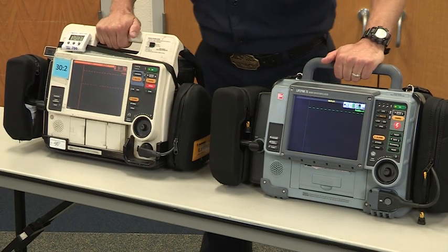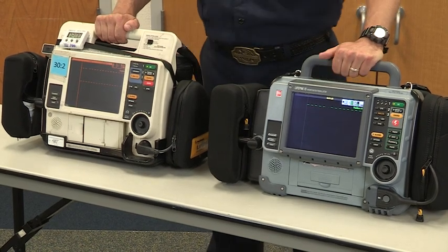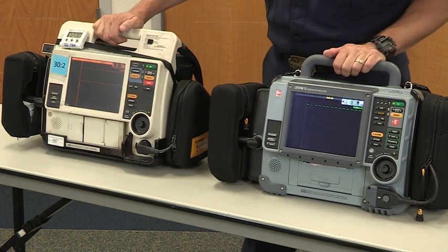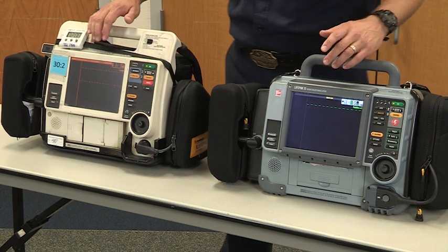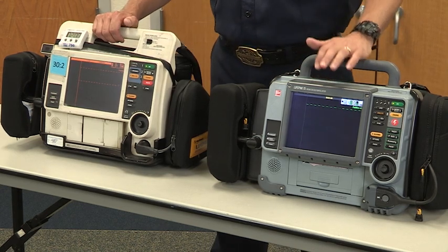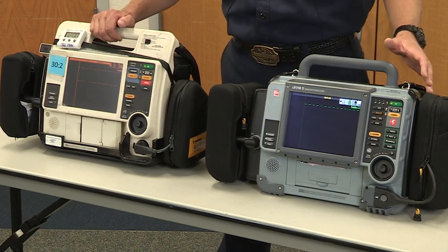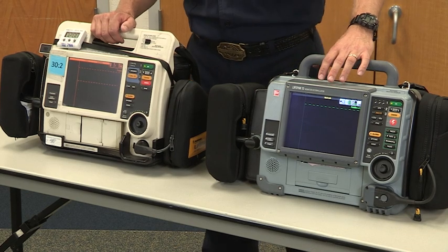Okay, now I've got each machine side by side so that we can view the similarities and the differences. Each machine functions identical to the other one as far as charging and shocking, button location, and printout and reading. However, there are some differences on the LIFEPAK 15 that I'm going to give just a brief overview of right now, and we'll go into more detail later in the video with each one of those differences.